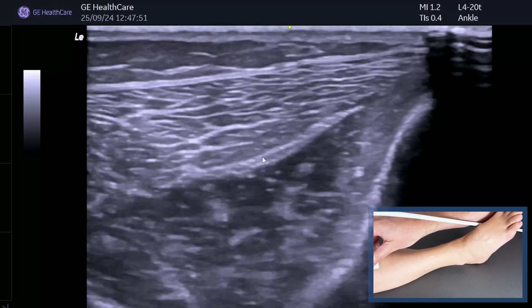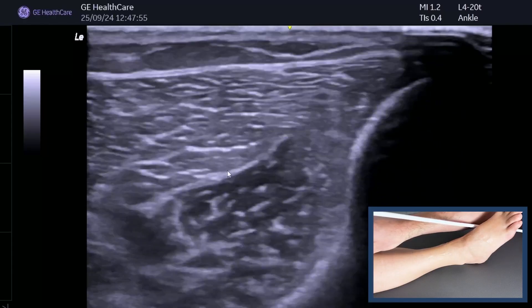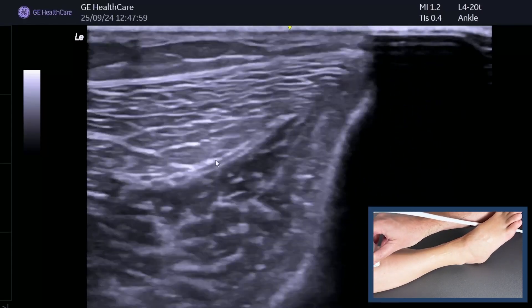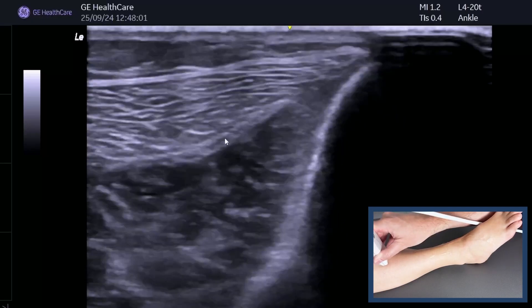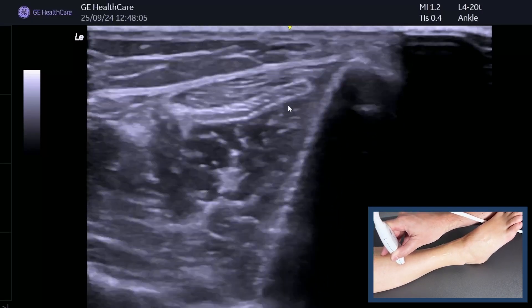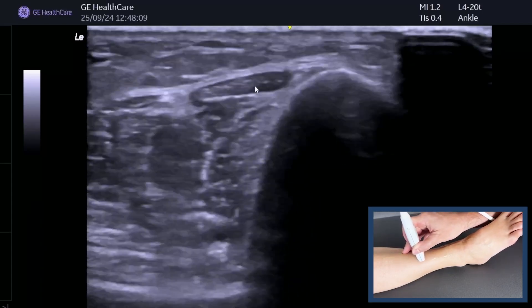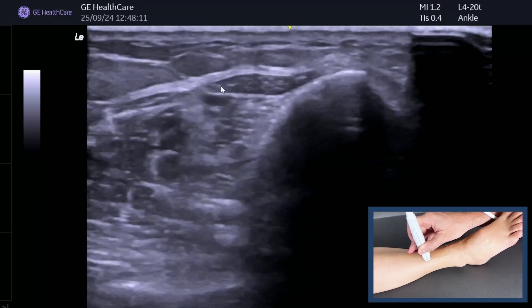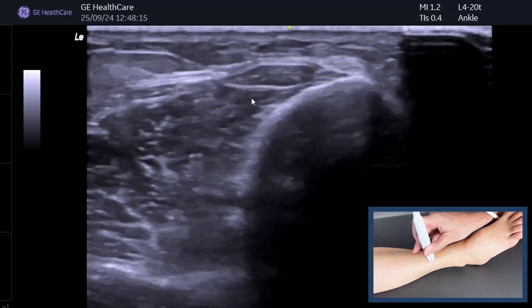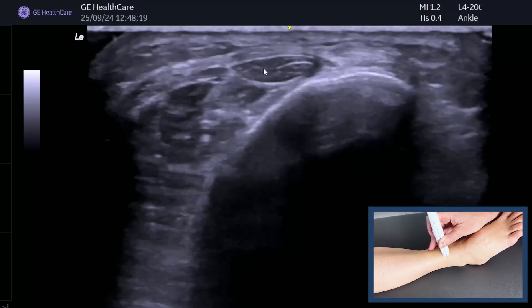You can see this is the tibialis anterior intramuscular tendon and you can actually follow it all the way up until it starts to become smaller. As we come back down you really see the way that the muscle forms the tendon. Keep tilting the probe and follow it all the way back down to the anterior ankle — there it is sitting next to the tibia. You can see the last few fibers of the muscle belly going in.